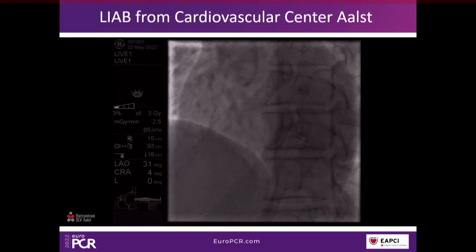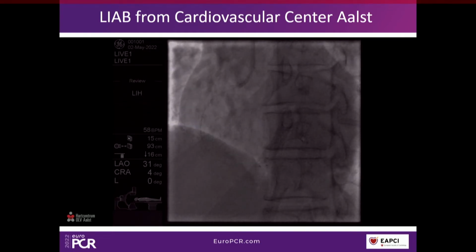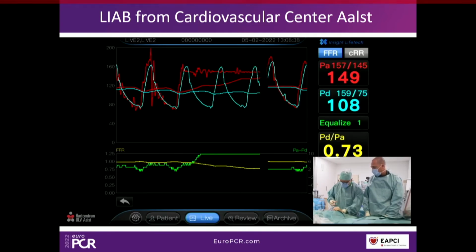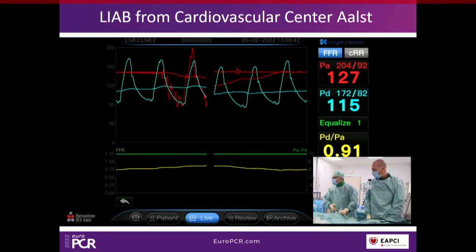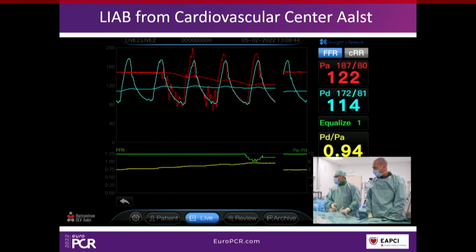Let's go. I would go just beyond this diseased segment. That's right. That's a good place to land. As usual, we give this 3 cc papaverine. We can start recording.